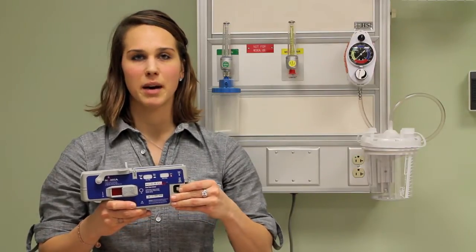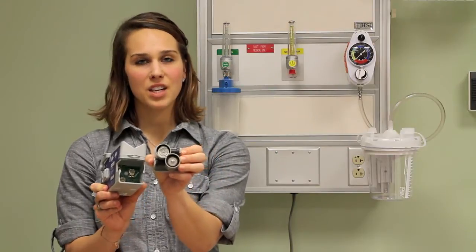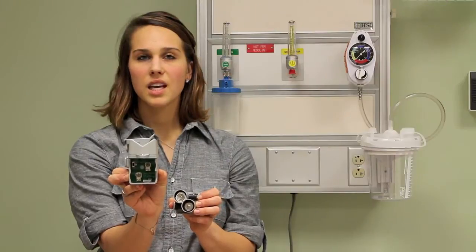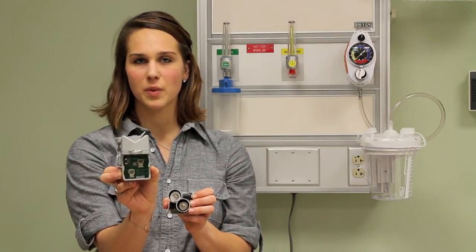The dual and extended rate pumps have an additional feature: a rate lock switch inside the battery compartment. To remove the battery caddy, squeeze the retention tabs on each side of the Microfuse pump and slide it out. The caddy holds two C batteries. The lock switch is inside the battery caddy compartment. If the switch is set to lock, the rate you have already chosen cannot be changed. To change the rate later, you'll need to set the switch to unlock.